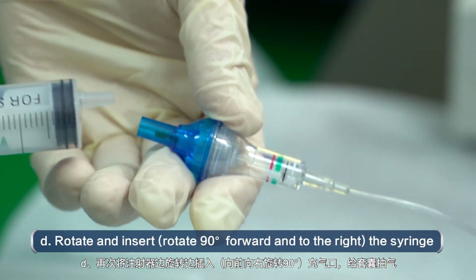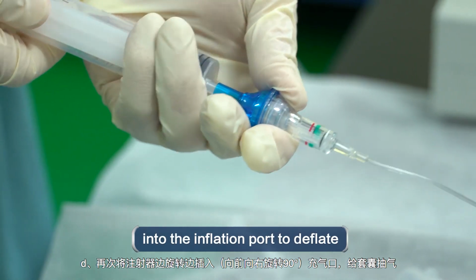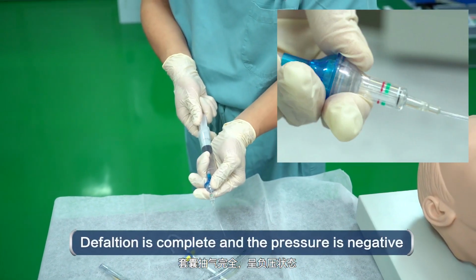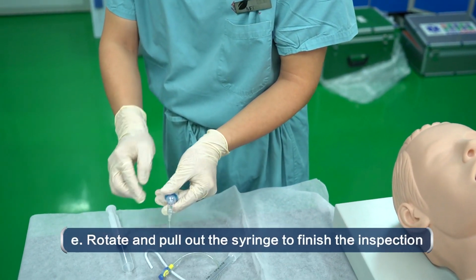D. Rotate and insert the syringe into the inflation port, rotating 90 degrees forward and to the right, to deflate. When the black ring is on the white line and stable, deflation is complete and the pressure is negative. Rotate and pull out the syringe to finish the inspection.